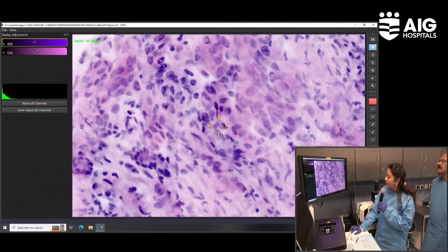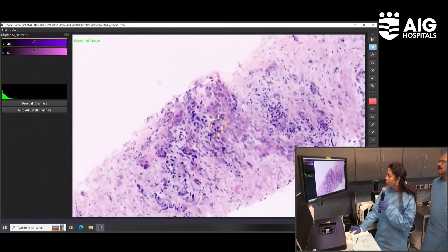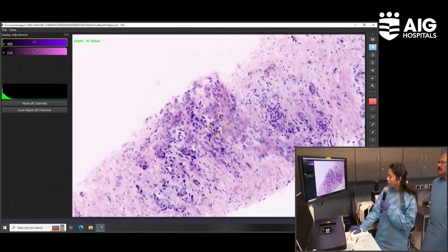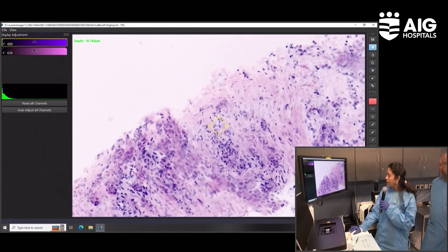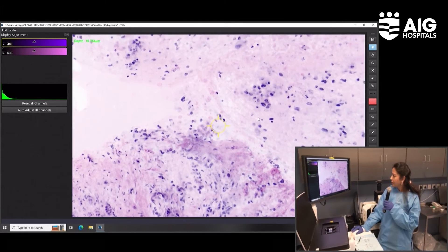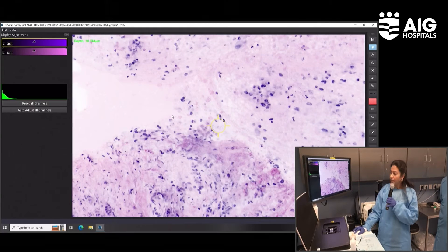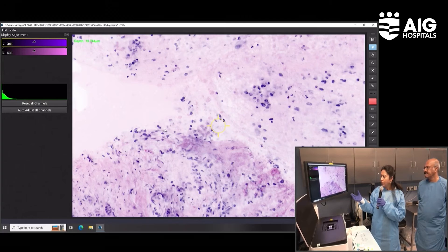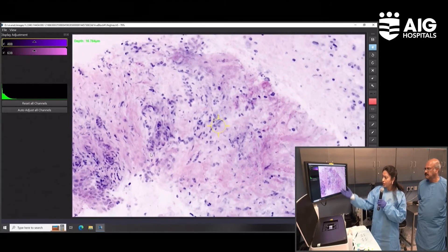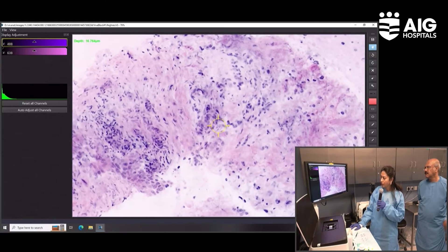I am zooming in — you can see overlapping cells. This cell is almost three times the size of the adjacent cell, indicating the degree of anisokaryosis. The advantage of FNB is to look for stromal invasion. This is all stroma, and you have these glands going right across the stroma. This gives us confidence to label it as a malignancy — and by the morphology, it is an adenocarcinoma. The stromal invasion is definitive of a neoplastic etiology, along with clustering and loss of polarity of the cells.